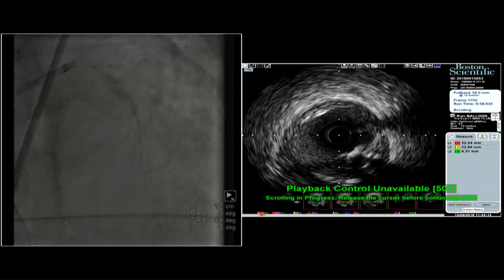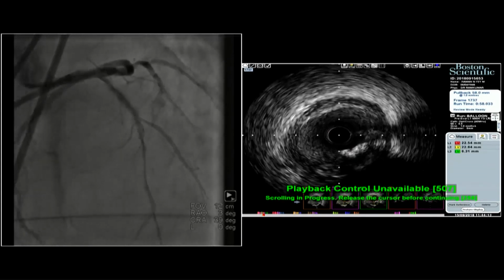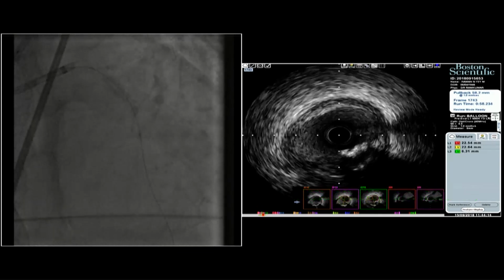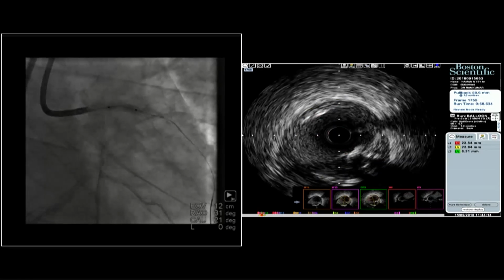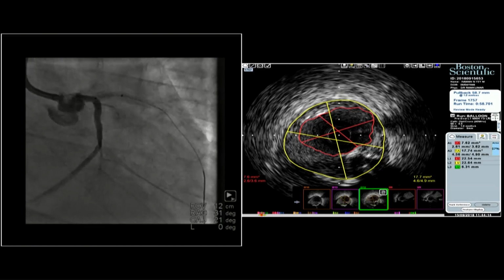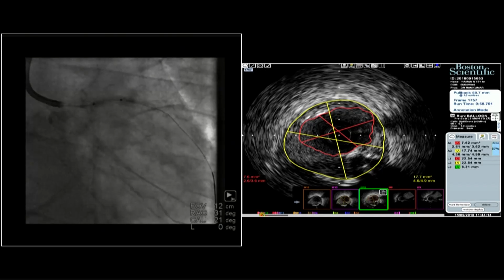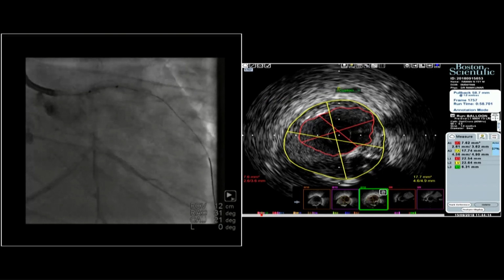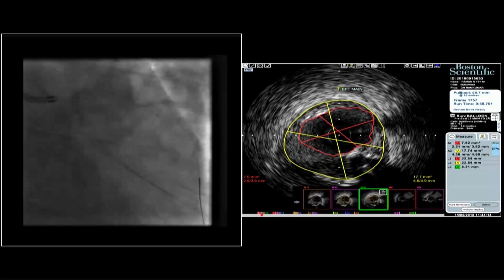We did an AngioSculpt after that, and the AngioSculpt also did not give way that easily. So now we are going up with a high pressure balloon called the OPN balloon. It goes up to 45 atmospheres. Okay, we've done all this, so I'll just take a shot, and then we will proceed with the high pressure balloons. Can we go live, full screen, please?